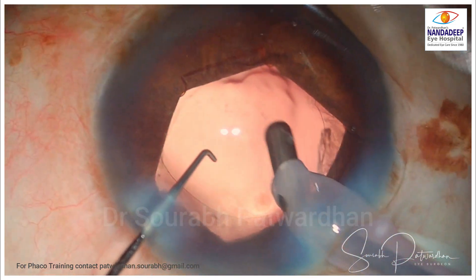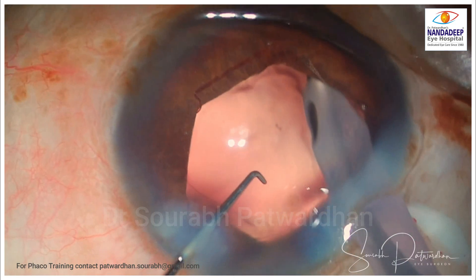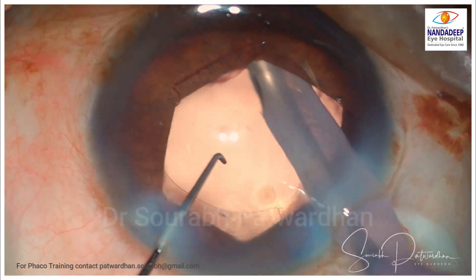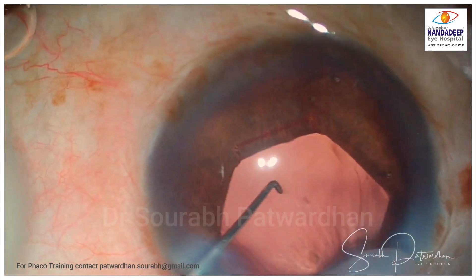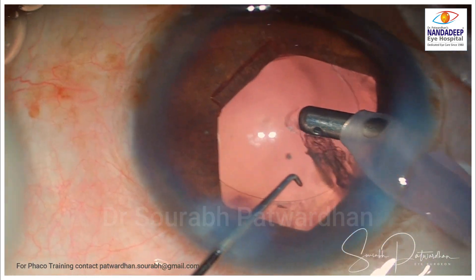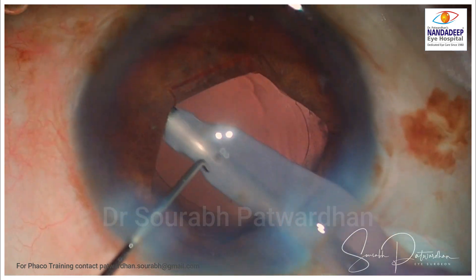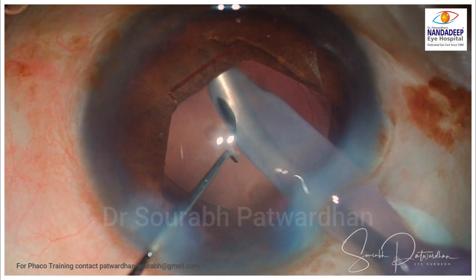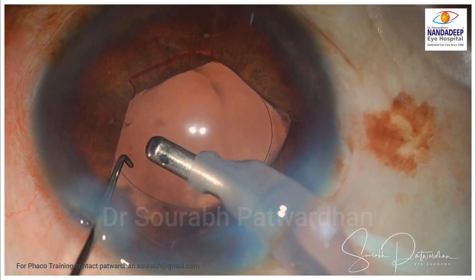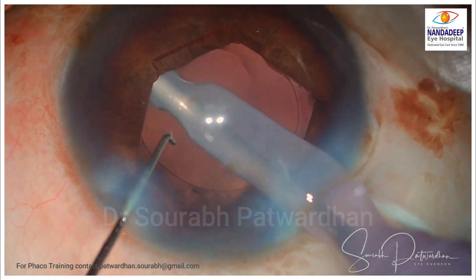In these cases, cortex removal is important. What is different from an immature cataract is that there is no anterior cortical sheet, so you actually have to go to the equator of the bag. Use around 20 mmHg vacuum near the equator to catch hold of the cortex and then pull it toward the center. Using low vacuum in the far periphery of the bag is the key — otherwise you may have cortical remnants at the equator. Rotate the IOL after putting it in the bag 2-3 times so peripheral cortex gets dislodged, but it is important to remove it, otherwise it will cause persistent inflammation and early PCO.